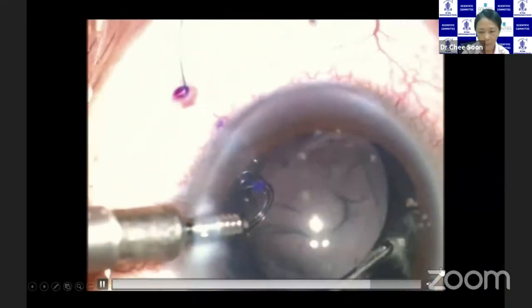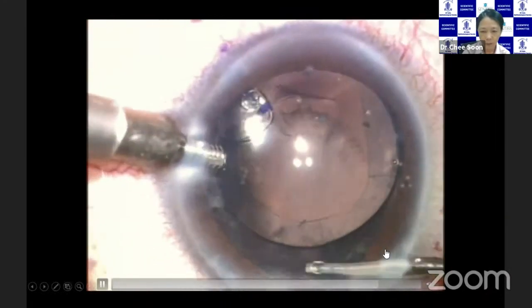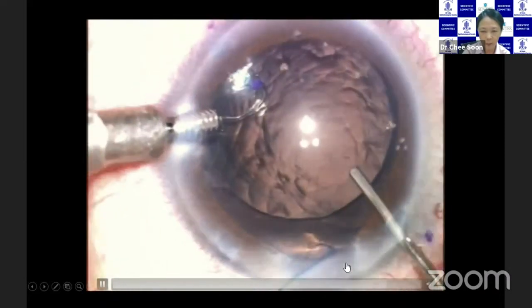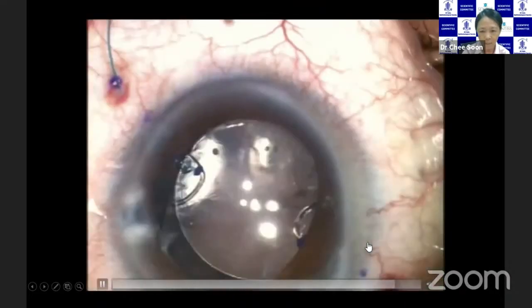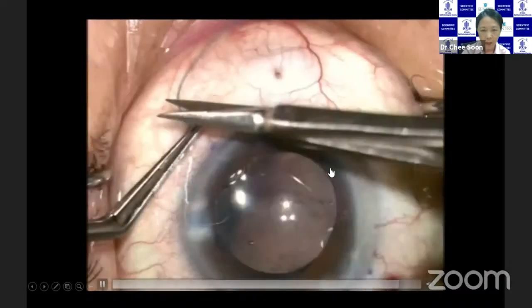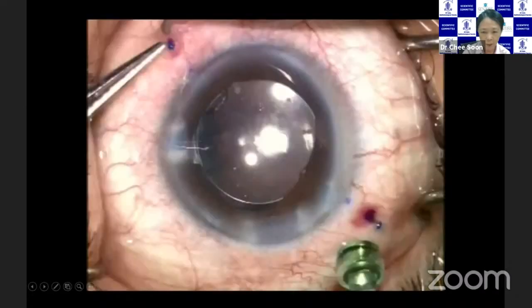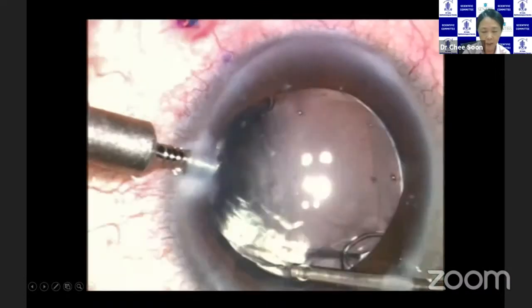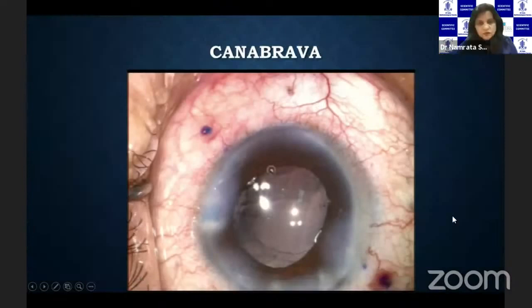And I'm not very happy here because I had some vitreous coming through just now. And so I'm then doing the vitrectomy here, right? Both behind as well as amputating one that comes in front. And at this time, then I insert the capsule tension segment and apply the traction. And it's important that you apply the traction first before you decide on what length, usually about 3 mm length for the diathermy. And then make sure that this is really covered by conjunctiva nicely. And at the end, you can insert some triamcinolone and then remove any residual vitreous.